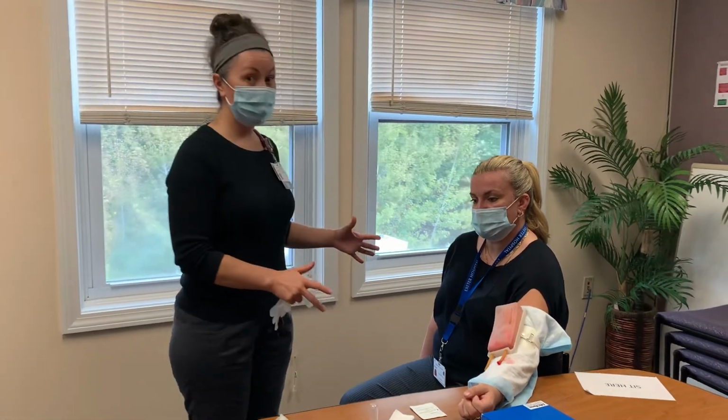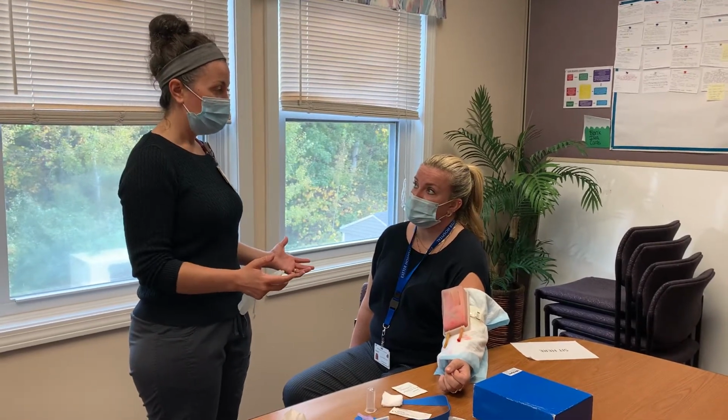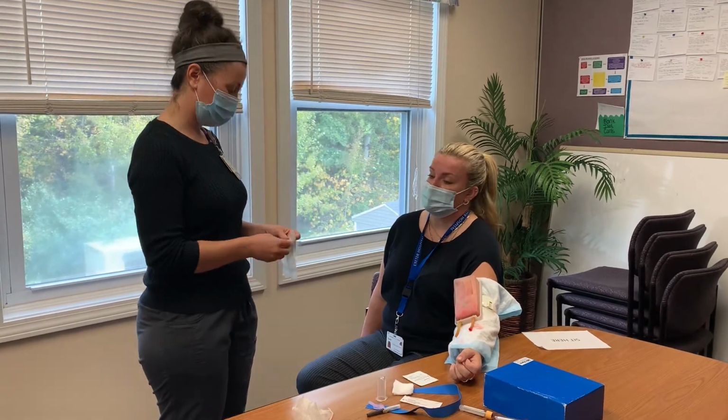Always make sure your patient is sitting comfortably, not on a stool or on anything that, in case she passes out, she would then fall on the floor. Have you ever had complications or passed out when giving blood? No. No, okay.